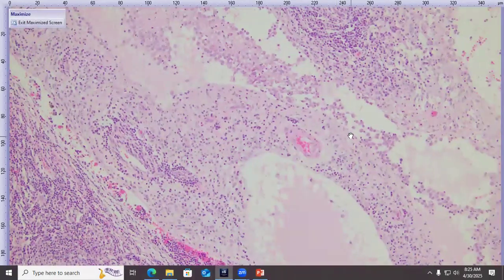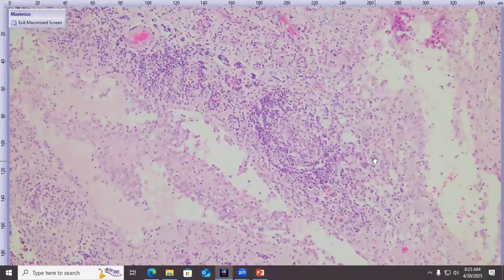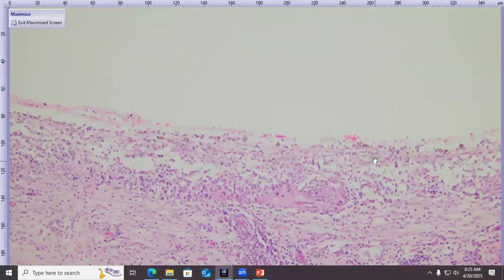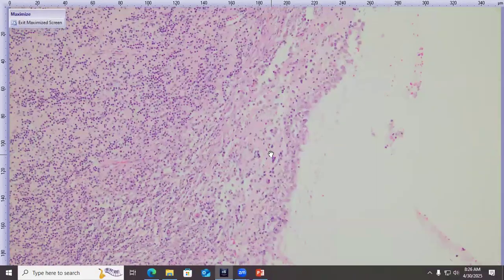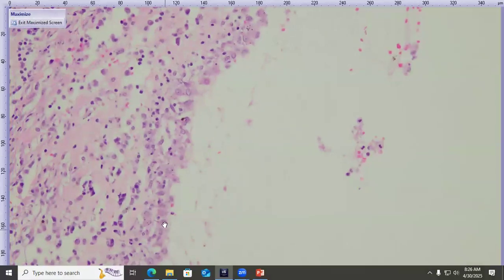We can see that there are some areas where the retina is recognizable but really severely atrophied. So here's a segment of detached and very atrophied retina. And then interestingly, the inflammation really does involve the retina. It's pretty severe retinitis on top of everything else. As we're back here, we can also show off that more so in the posterior segment, there are these linings of epithelioid macrophages along the intraocular surfaces. Here's a good example of that, actually. So an epithelioid macrophage is forming a sort of carpet along some of the intraocular surfaces, but otherwise sometimes it's just severe distortion of the entire uvea.